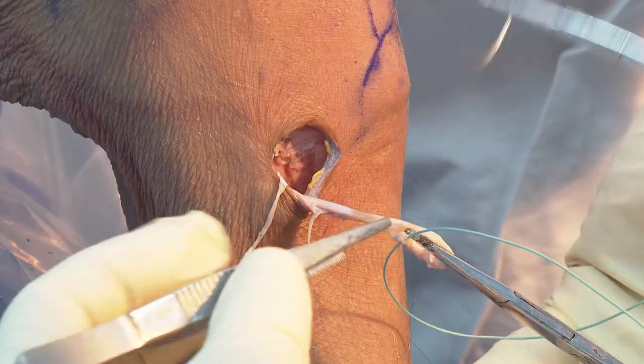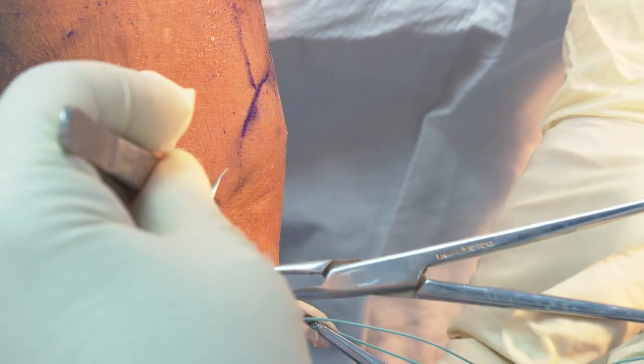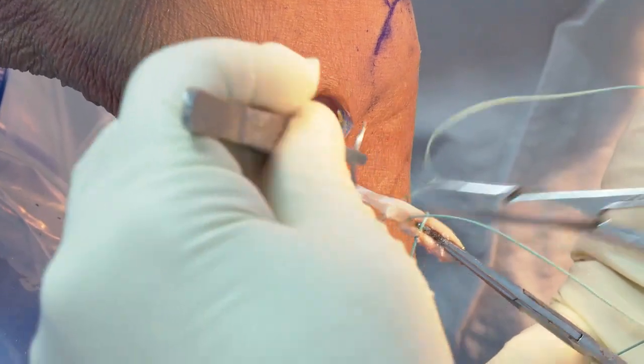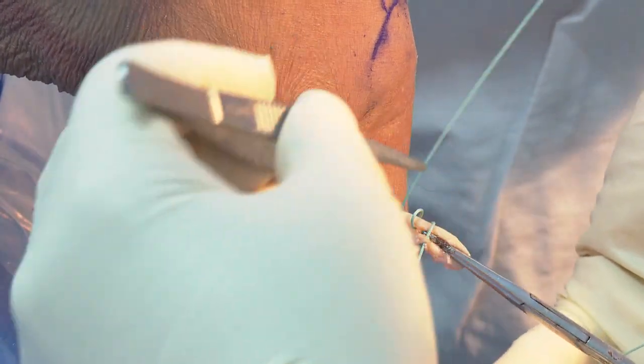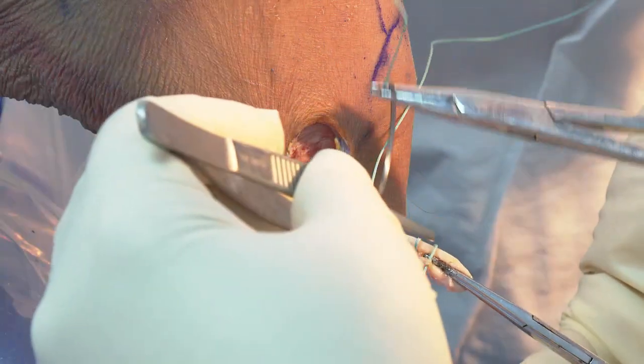Okay, to your ear. When the needle is pulled out, pulling it to your own ear is enough, no need to take it further back. But do not contaminate your ear, do not prick your own ear. Just the level of the ear. Okay. Good. Okay. Go around.